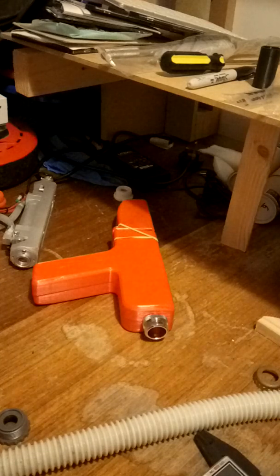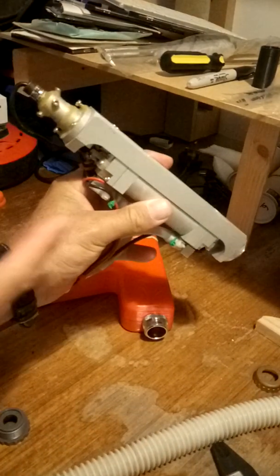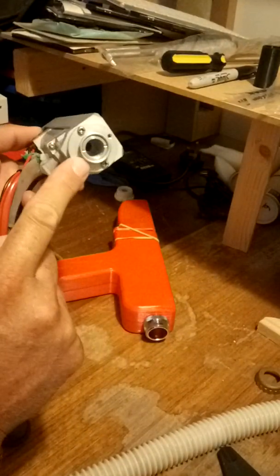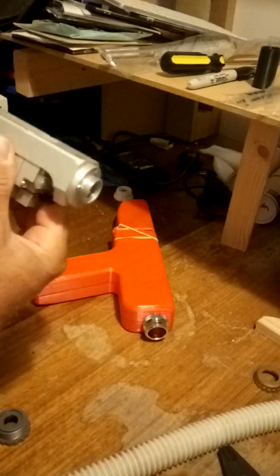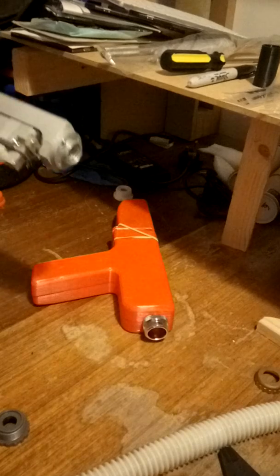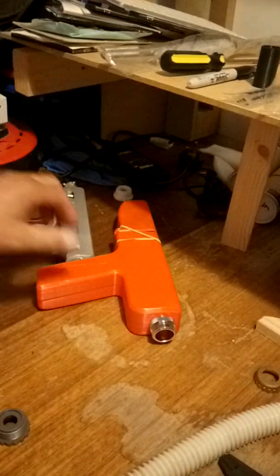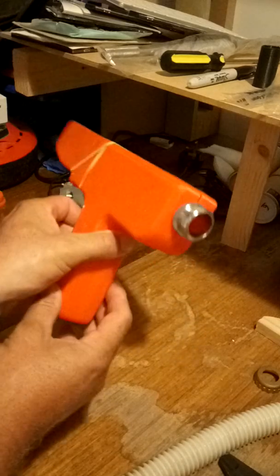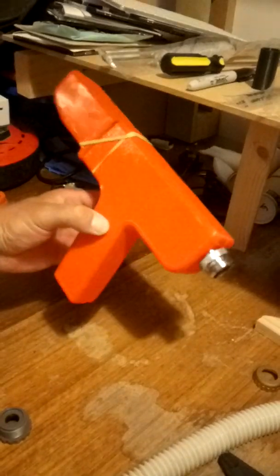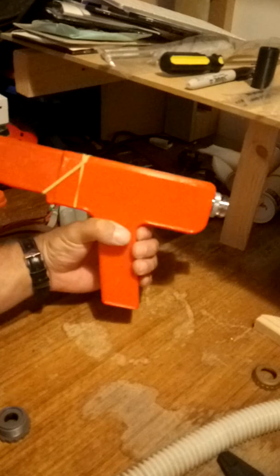I just wanted to show you, this was the usual laser at the minute. We've got the red aiming dot, usual, and the bit at the end where I've got all my prototypes, lenses, etc. Well, something quite interesting came up. One of my prototypes was the handle. So here we go. At the minute, yes, it's a non-working prototype. As you can see, it looks a bit like a Star Trek phaser. If I hold it like that, you see what I mean.